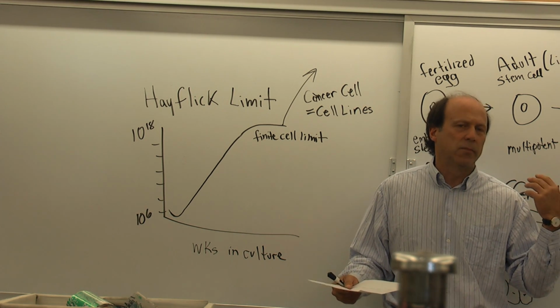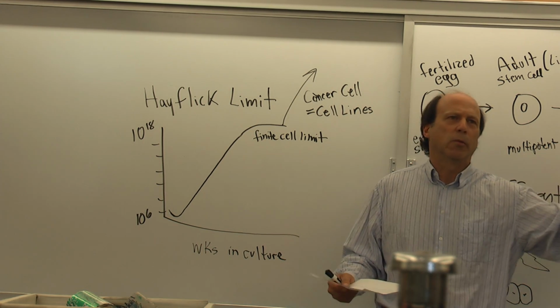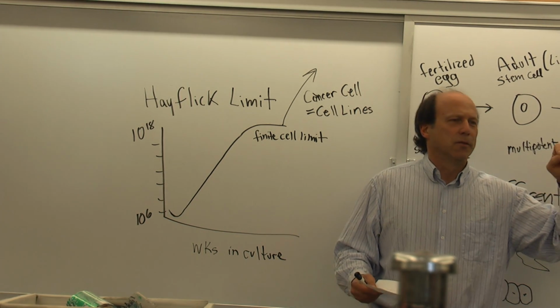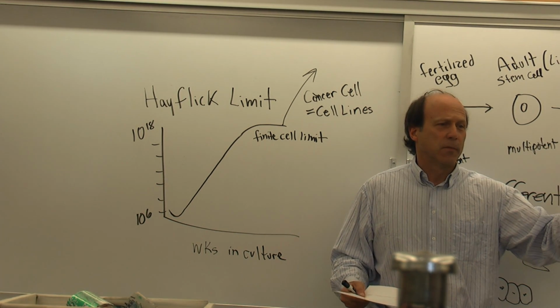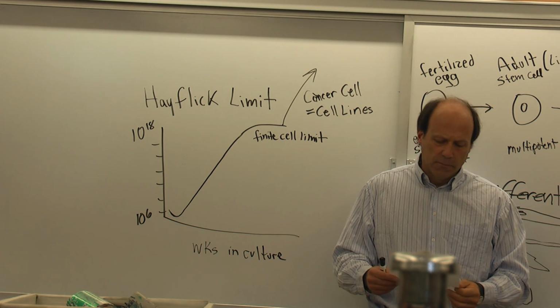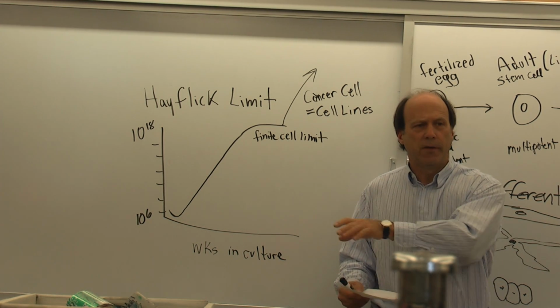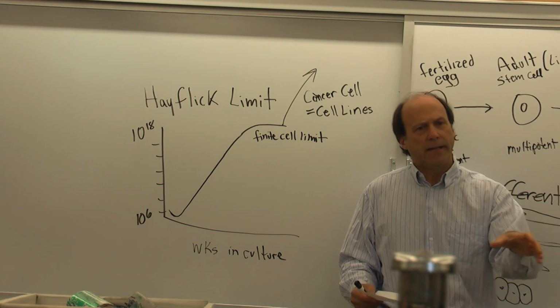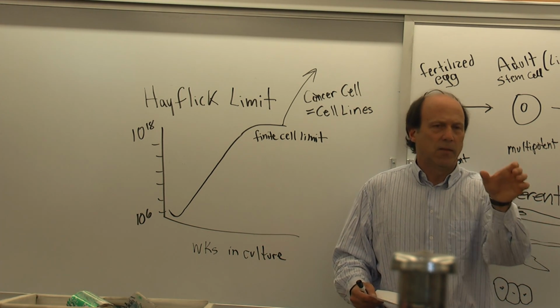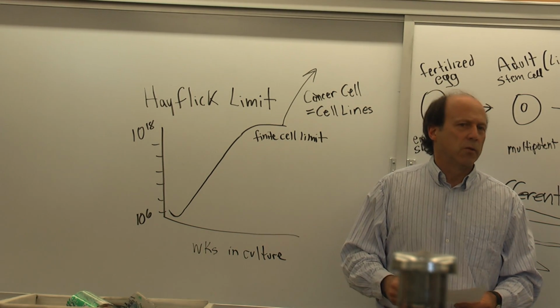We're going to be isolating some skin cells, but they're from Joe and Barbara, and actually not Barbara, so they're all males, apparently, because we're actually using foreskins, right? So all these male skin samples that we have. But there's variation, patient to patient variation. So this is not a WI38 cell or a HeLa cell. It's not something you can go to the ATCC and get as a particular cell line. Those are cancer cells. We're not dealing with a cell line.